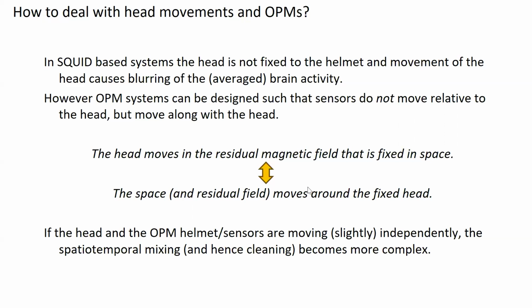If the head and the OPM sensors are moving slightly independently from each other, so if you imagine an OPM helmet that wobbles on the head if the participant is moving the head, then the spatial temporal mixing becomes, and hence also the cleaning becomes, quite a bit more complex. So the OPMs being fixed to the head, I think, is an important requirement for data cleaning to be efficient. So it's just something to consider if you're designing your own helmet.